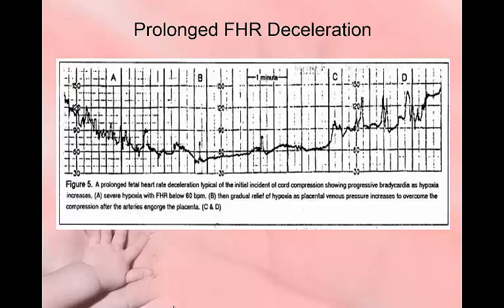We don't really know. So reposition her, give her an IV fluid bolus, get oxygen on her. If she's got oxytocin running, of course, turn it off. And we want to notify the healthcare provider. If this pattern resolves itself, which it looks like it is doing here towards the end of this tracing, then it's something that we'll continue to watch and monitor.